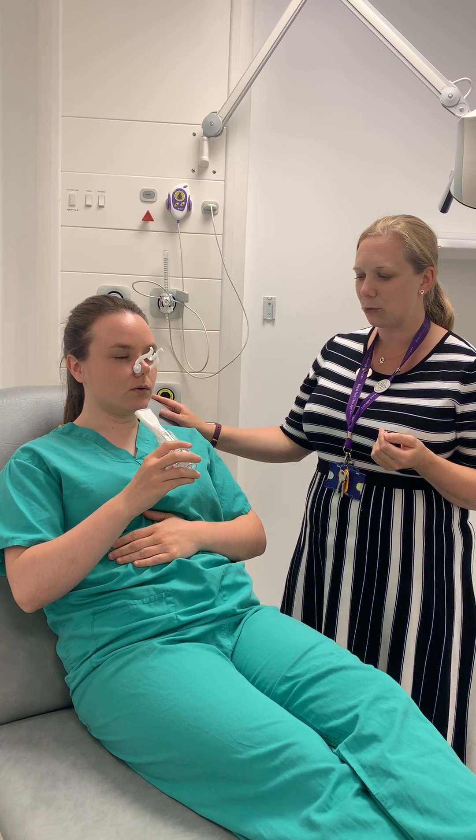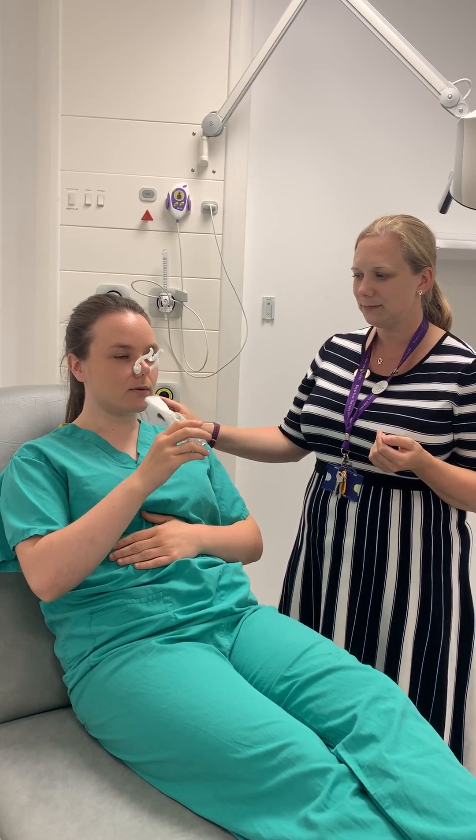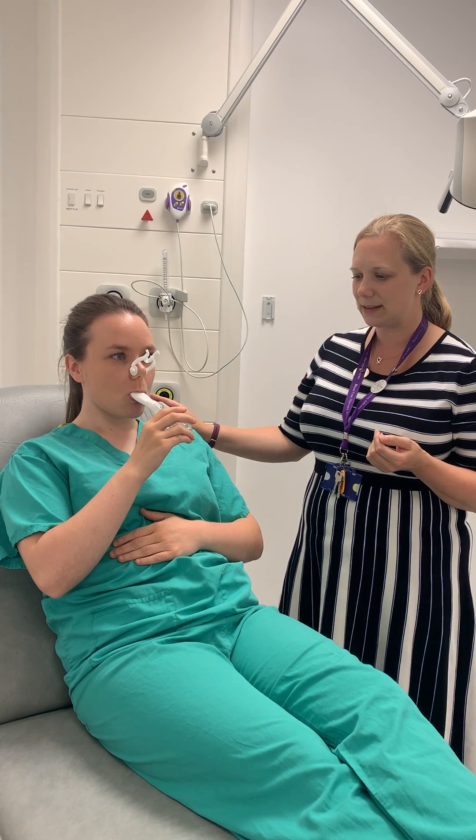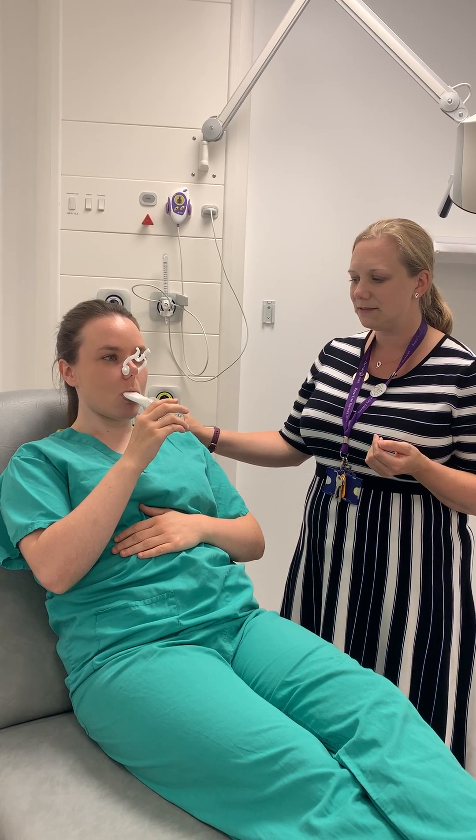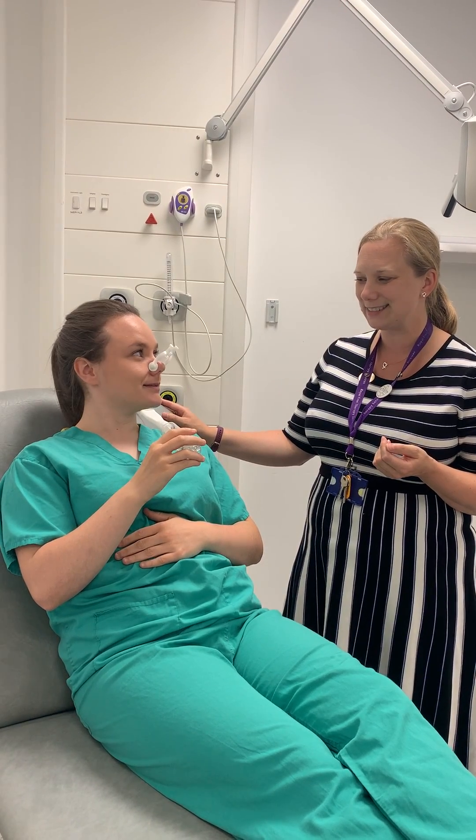That was a good first go though. So breathe all the way out, nice tight seal and nice slow deep breath in, deep breath in. Keep your shoulders relaxed. Fill your lungs up and relax.